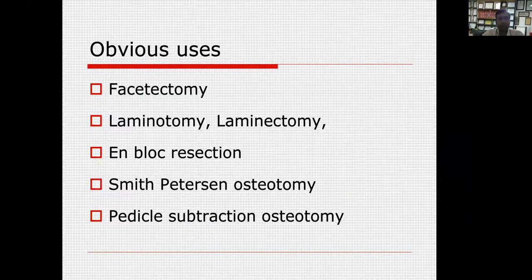So obvious uses are in facetectomies. You can use them for laminotomies, laminectomies, en bloc resection of the bone. You can use them for Smith-Petersen osteotomies or pedicle subtraction osteotomies. So these are the common uses. There are other uses as well.